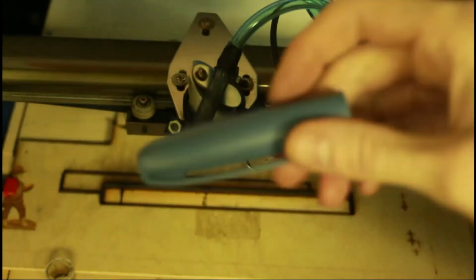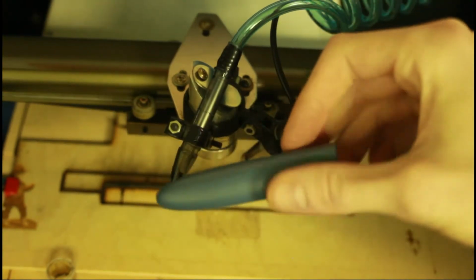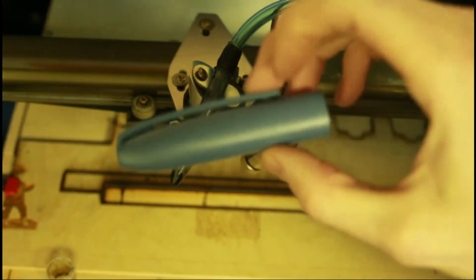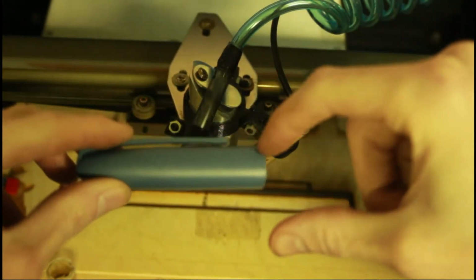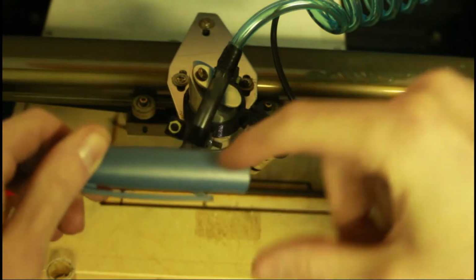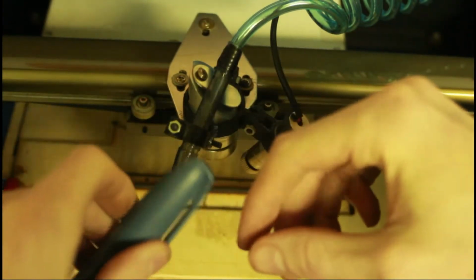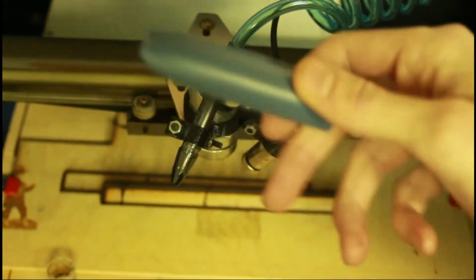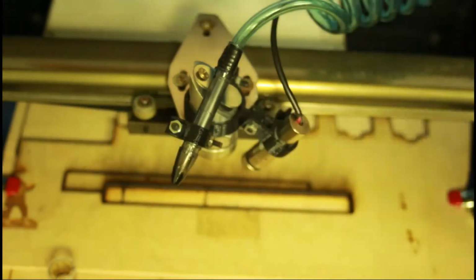Next step, of course, is the pen cap. And this part is where we're actually going to be putting the syringe in and then into the pen. And with this, we also need to use the laser cutter because, again, we need precise cuts here and here, like notches that the wings can fit through, and also a cut here for the end of the syringe to fit through. And we need it precise, of course, in order to make sure the syringe is nice and snug. Let's go ahead and get that started.